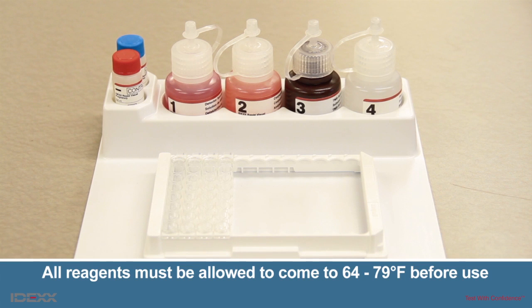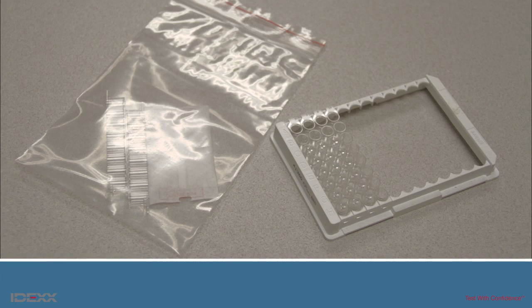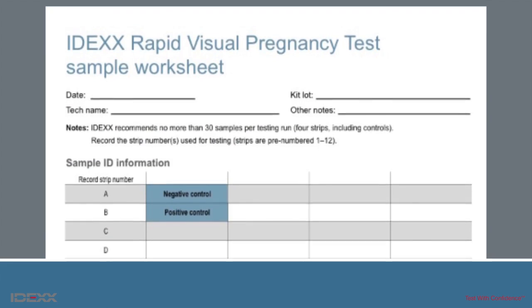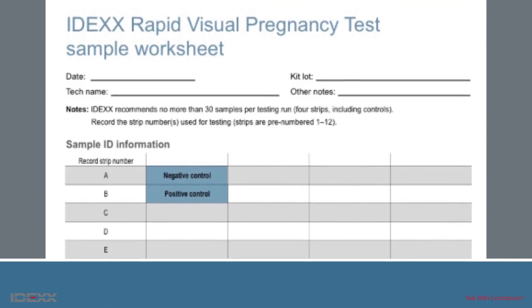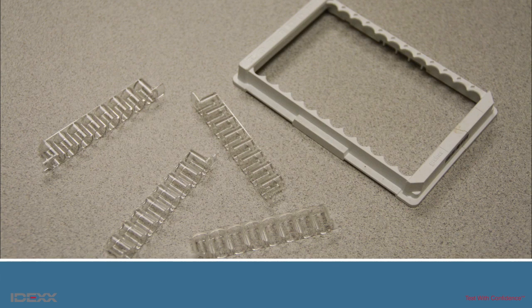For your convenience, IDEXX has designed the internal packaging, which holds the kit components in place, to be used as a workstation. To start, open the foil pouch containing the plate and remove only those strips needed for the number of samples to be tested. Place the remaining strips, along with the desiccant, in the extra Ziploc bag provided and return to 35 to 46 degrees Fahrenheit. On the worksheet, record the positions of the negative control, positive control, and samples. IDEXX recommends placing strips in numerical order — the order doesn't have to be exact. Orienting the strips correctly with tabs up will prevent an issue if strips happen to fall out from squeezing too hard.